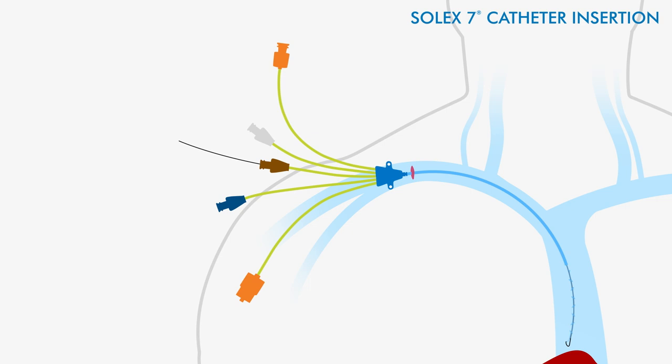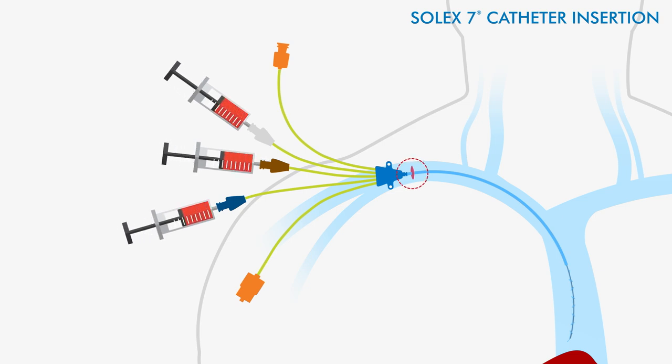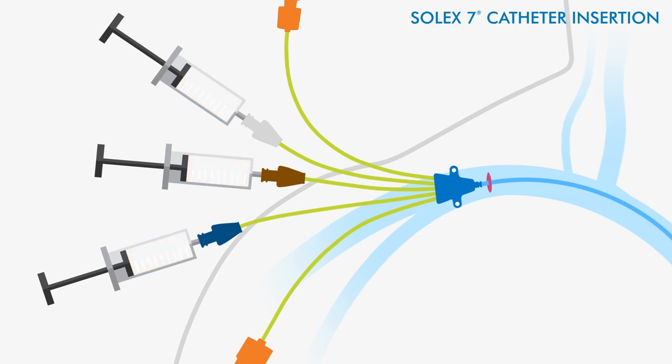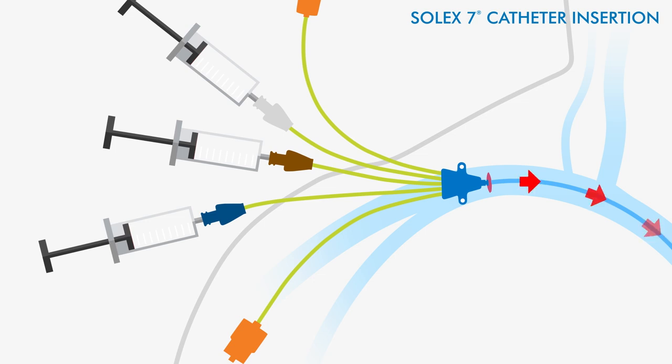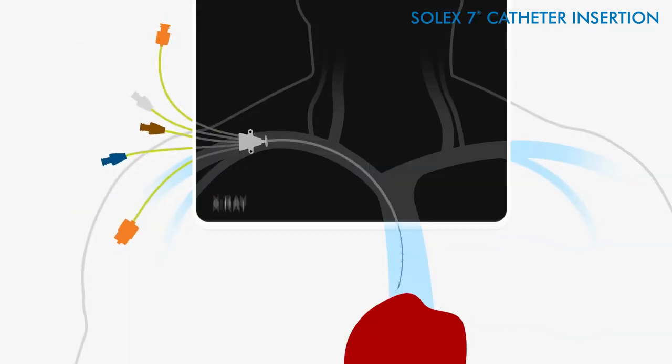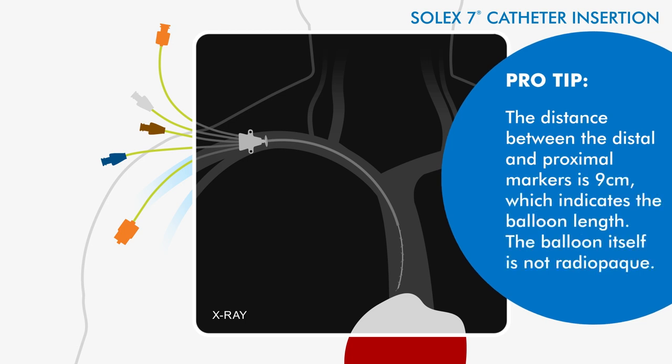Once the catheter is placed, remove the guide wire and ensure that the proximal port is fully inserted into the vessel by checking for blood return from all three ports. If there is no blood return from the medial and/or proximal ports, the catheter must be further inserted into the vessel. Verify the final placement of the catheter via chest X-ray. The distal tip of the catheter should reside in the SVC.